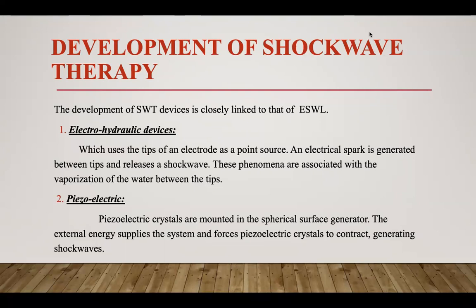This phenomenon is associated with the vaporization of the water between the tips. Second one is the piezoelectric. Piezoelectric crystals are mounted on a spherical surface. External energy supplies this system and forces the piezoelectric crystals to contract, generating shockwaves.